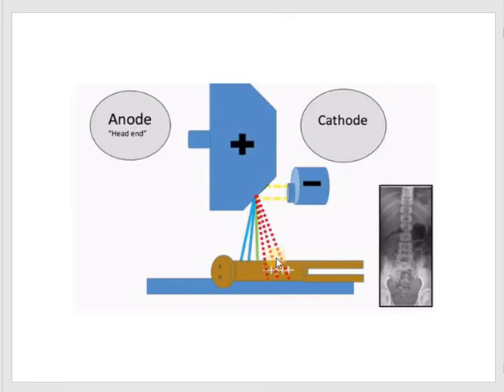Say that we are interested in the subject matter of this area, where you can see the density of the bones is of course higher than other extremities of the lower abdomen and the upper abdomen.